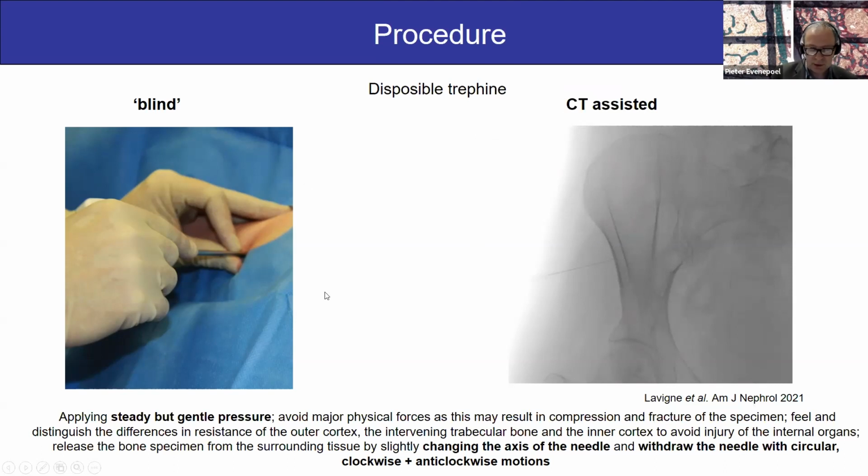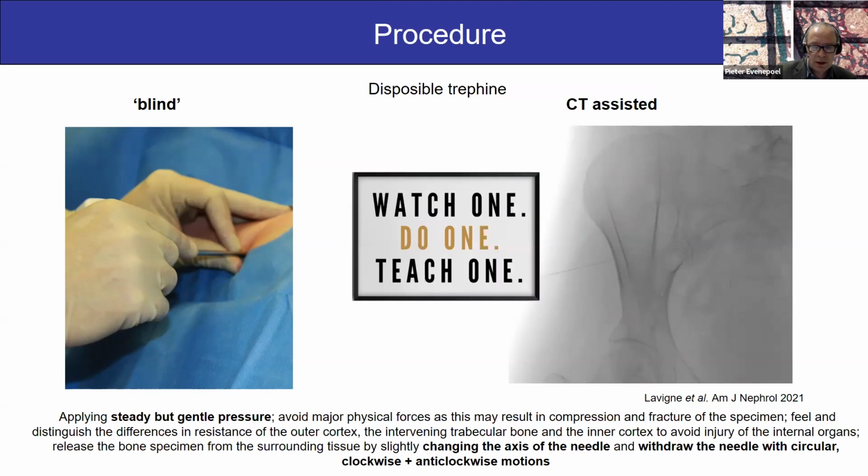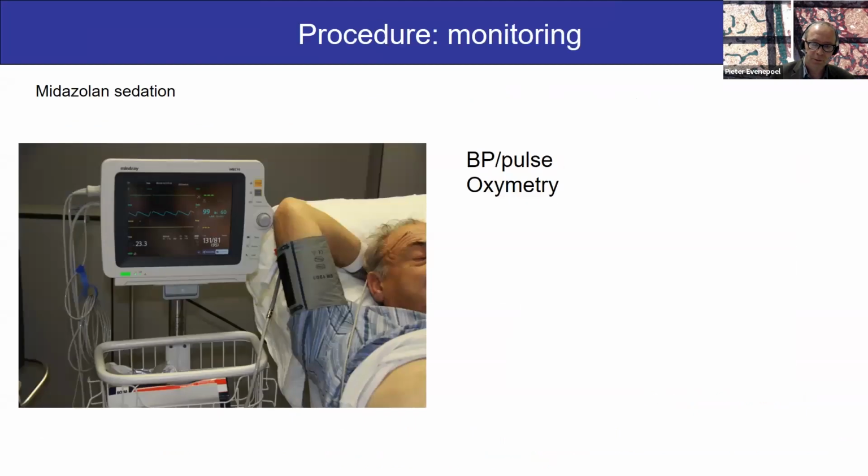As I will tell you in a moment, the complication rate is very, very low. I would say the procedure is rather easy, and so watch one, do one, and teach one can probably be applied to this procedure. I don't think you need a lot of training for it. There's always a learning curve, but it's a very steep learning curve, at least in my impression.